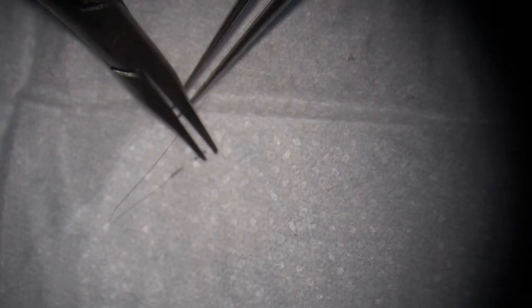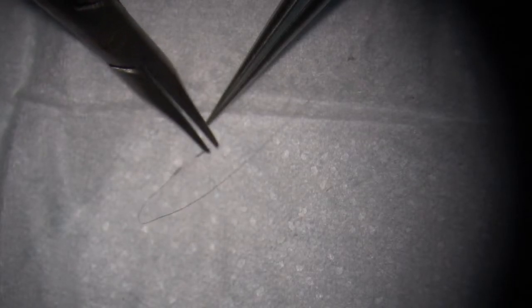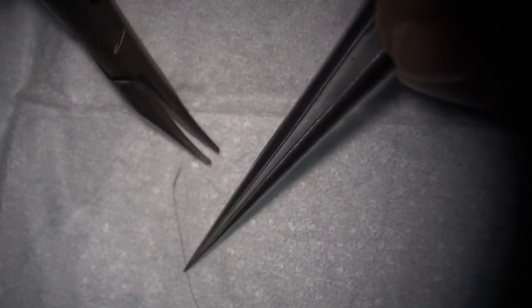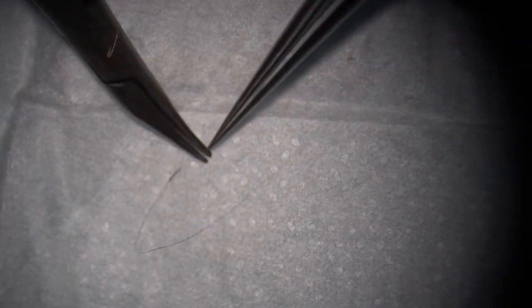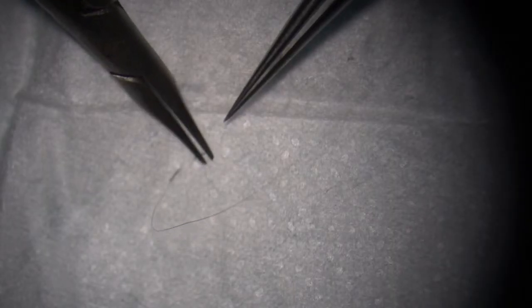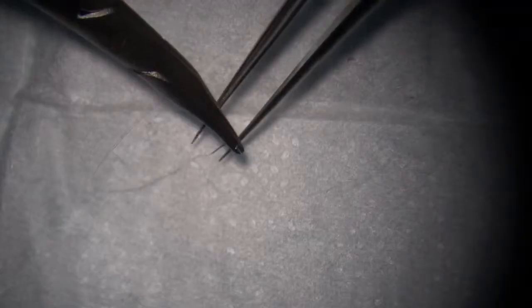Firstly, pick up the needle. If we hold the needle holder this way, because there's a curve of the needle, before we close the needle holder, one arm already hits the needle away. So in order to pick up the needle better, we turn the needle holder to match the curve of the needle. So we won't hit the needle away before we can close the needle holder, right? So this is one tip. Sometimes we try to use the forceps to pick it out but you can see the forceps is really tiny. It's hard to catch the needle very well sometimes.